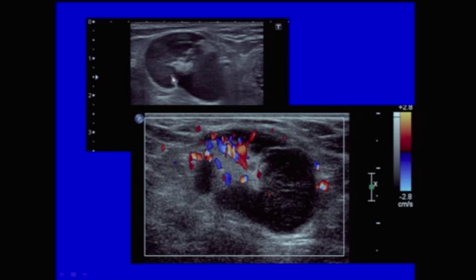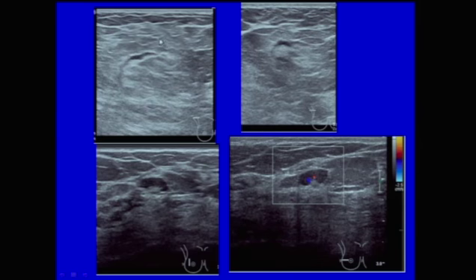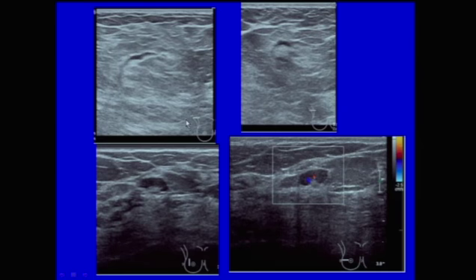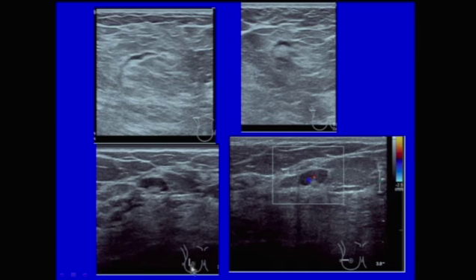Lymph nodes are included in the special cases section. Asymmetrical thickening of the cortex is very suspicious for metastatic lymph node involvement in the axilla. Lymph node size is not as important as the degree of hypoechoic cortical involvement. A large echogenic lymph node in the axilla is completely normal when the hilum is completely filled with fatty tissue. Two other normal-appearing sonographic lymph nodes in breast tissue look almost like kidneys — they have a hypoechoic cortex and an echogenic hilum, and flow can be seen going right into the hilum.